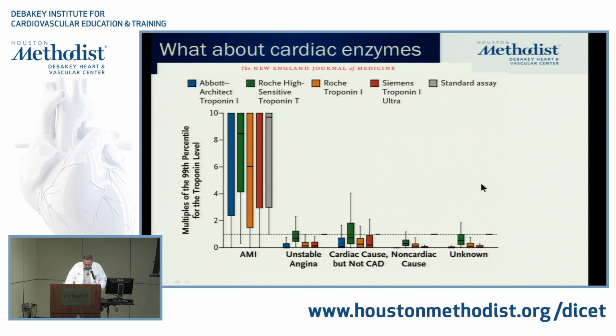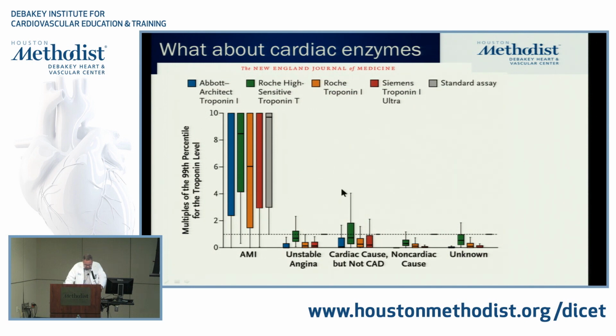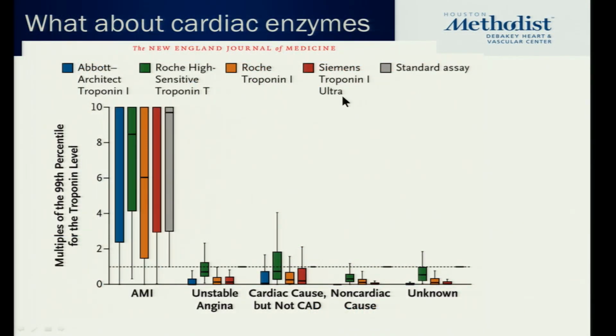And this was a study that came out in the New England Journal in August of 2009. And basically, you can see here, at that time they were using different companies providing the high sensitive troponin.